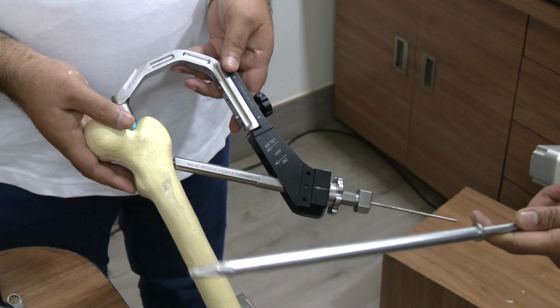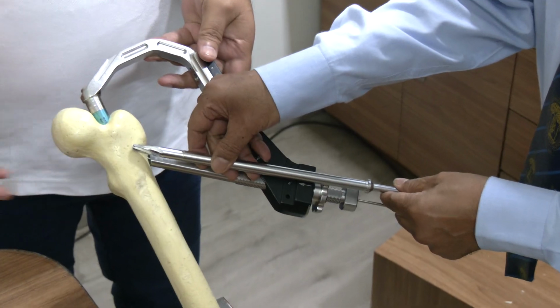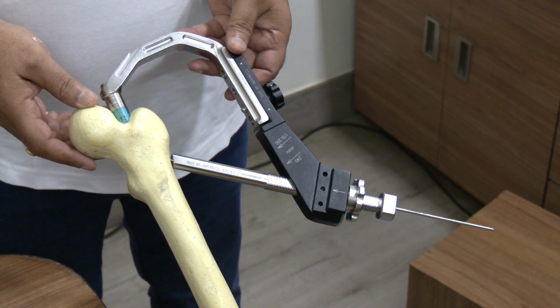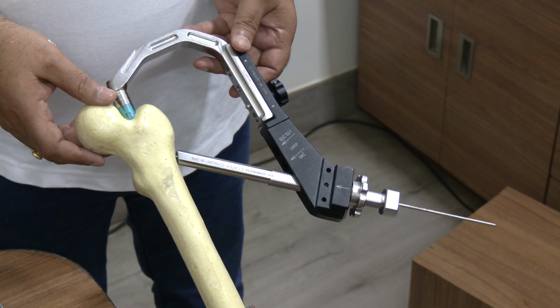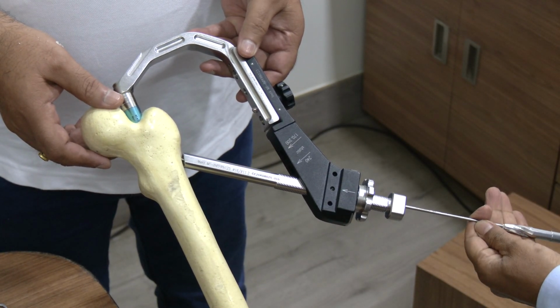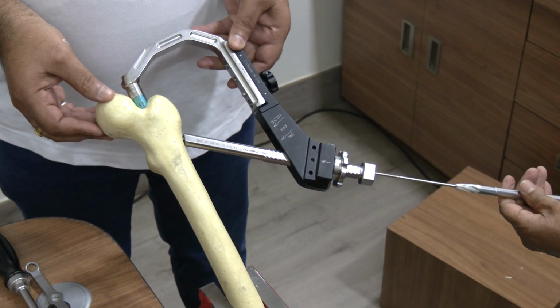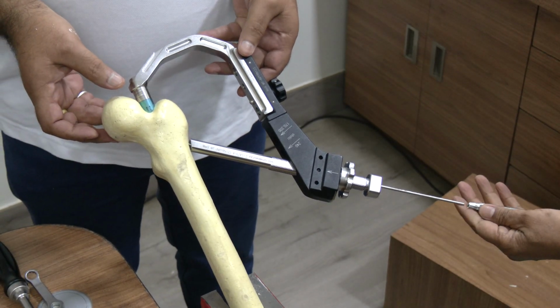This lateral opening device only opens up the lateral cortex and enters up into the nail. It doesn't go inside the nail. So I'll pass this first. I'm opening the lateral cortex now. Again, this has got a plunger. Since we used this lateral cortex opening device earlier for removing bone, there is a lot of bone inside this.